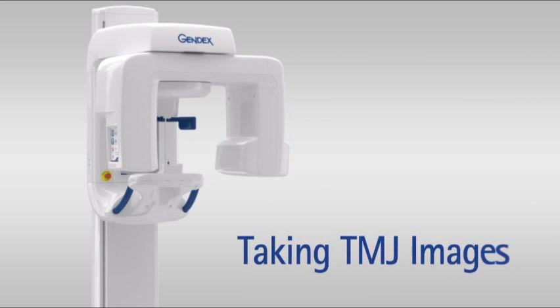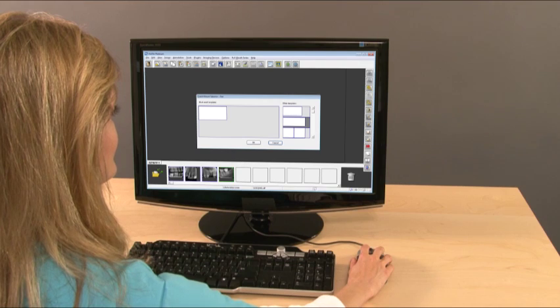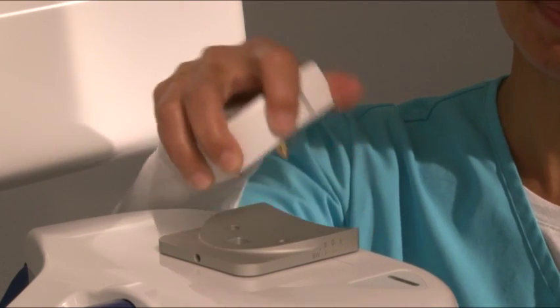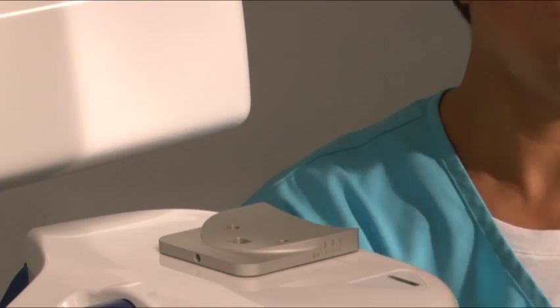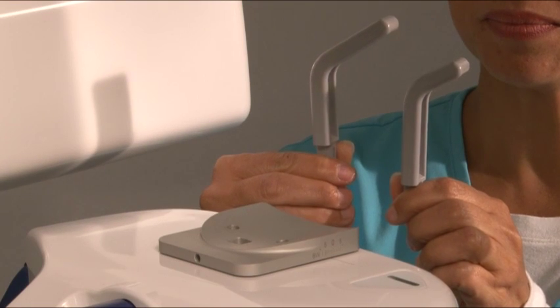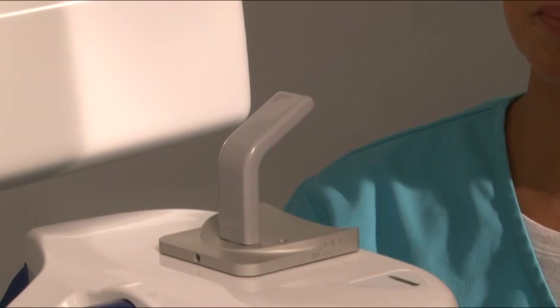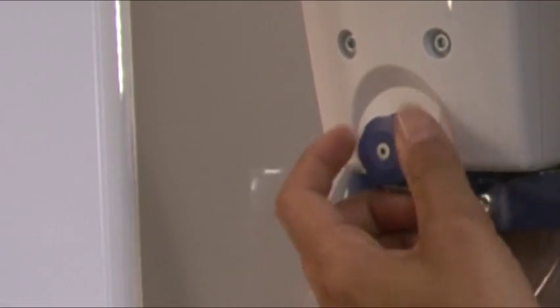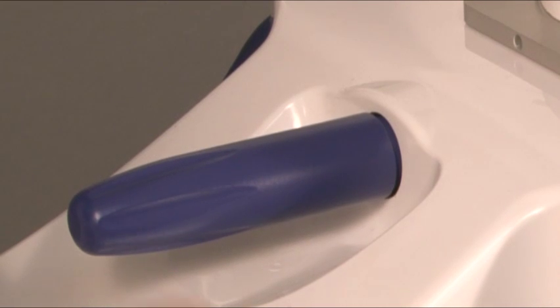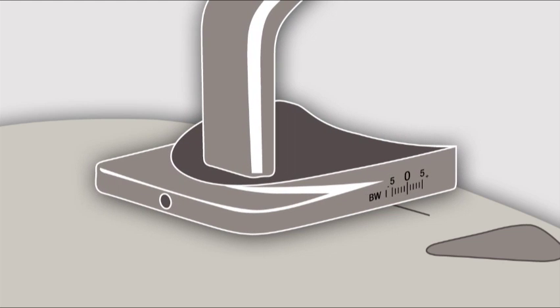Taking TMJ images. Set up the acquisition from within your imaging software. Prepare the system by removing the chin rest from the support holder, then placing the TMJ nose support into the support holder. Use the short nose support for large and medium sized adults and the long version for small adults and children. Fully open the head supports and place barriers on them. Use the focal trough knob to position the support holder at negative five for an adult and zero for a child.